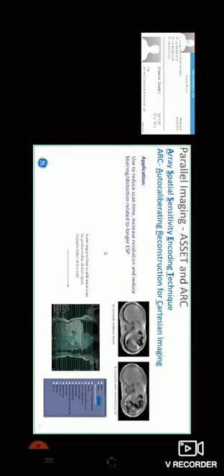So what it does is it oversamples the central k-space lines and undersamples the outer k-space lines, and the missing lines of the outer k-space are taken from the neighboring lines. So this is a data-driven or k-space based technique. It doesn't require any calibrations.